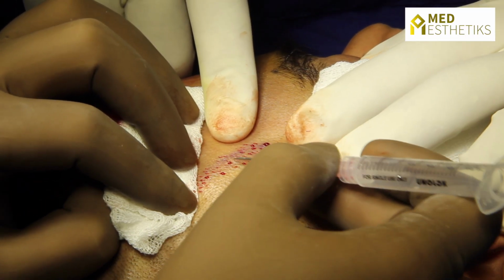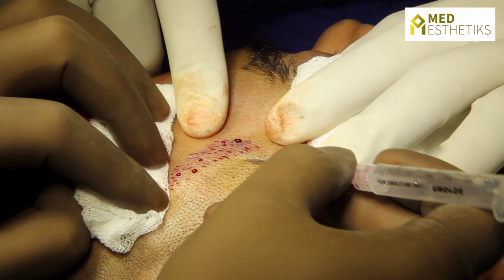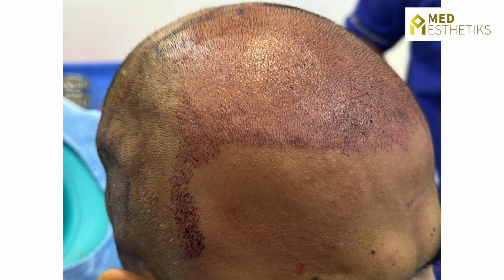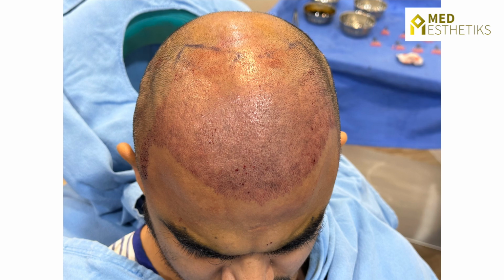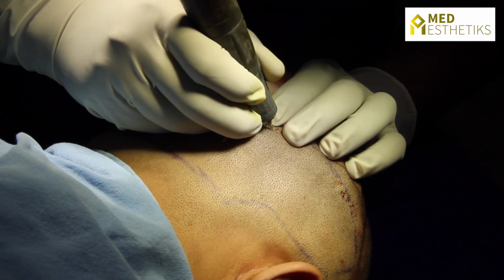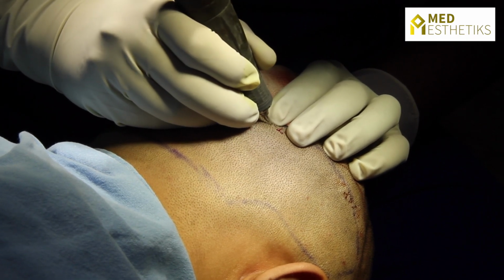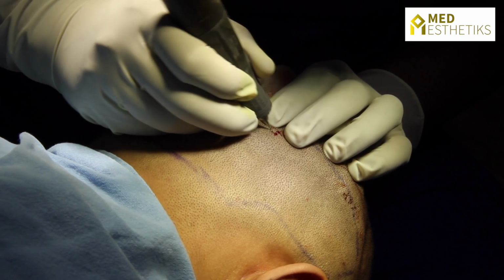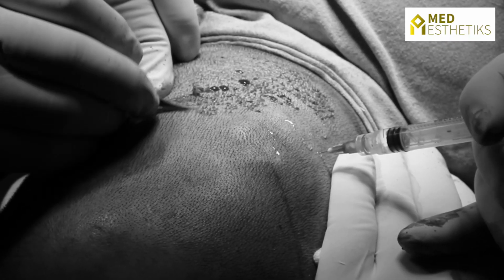In the temporal or the side areas, the angles are kept very acute so that the hairs grow vertically downwards. Now here you can see the final picture of the slits that we have made. Once the slits are ready, we inject local anesthesia in the donor areas, and then we start harvesting the grafts from the donor area using a motorized punch.